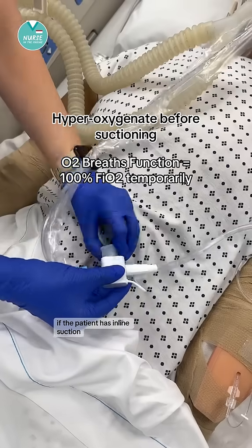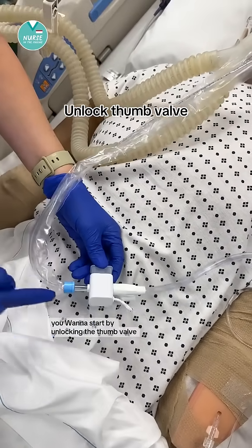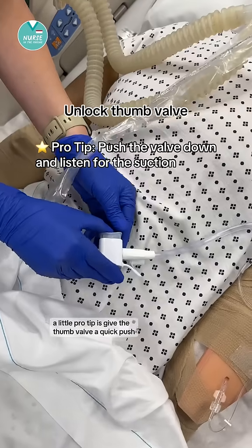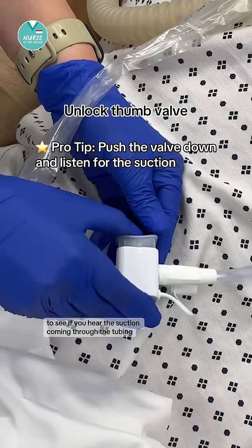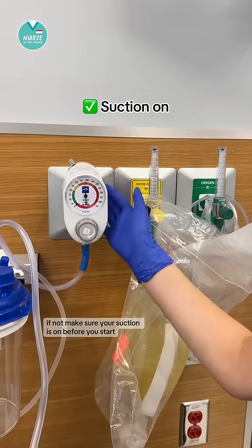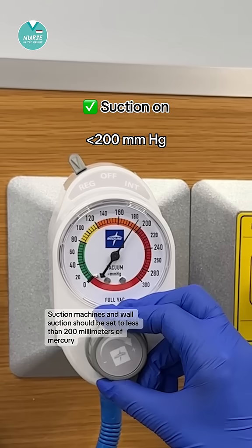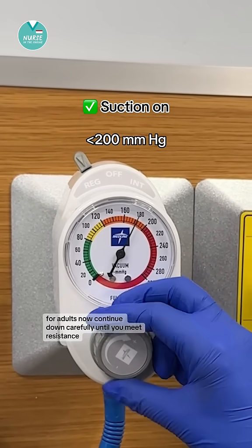If the patient has in-line suction, this is a quick, easy process. You want to start by unlocking the thumb valve — this should already be connected to active suction. A pro tip: give the thumb valve a quick push to see if you hear the suction coming through the tubing. If not, make sure your suction is on before you start. Suction machines and wall suction should be set to less than 200 millimeters of mercury for adults.